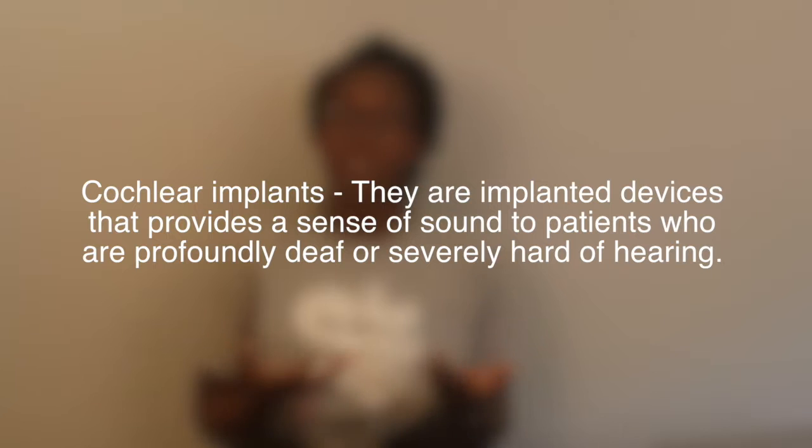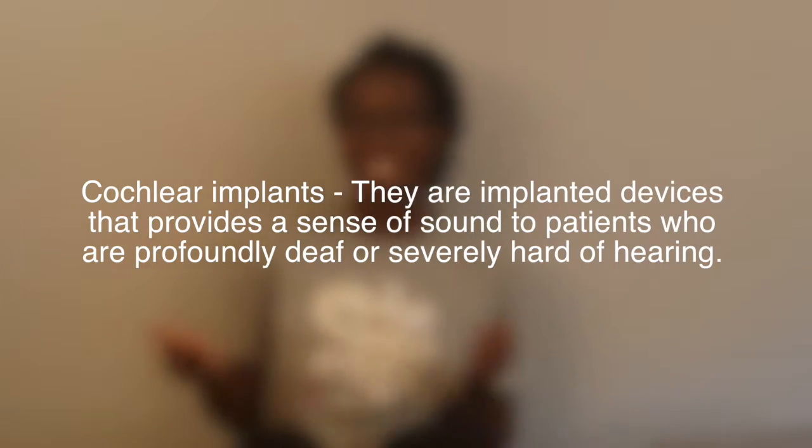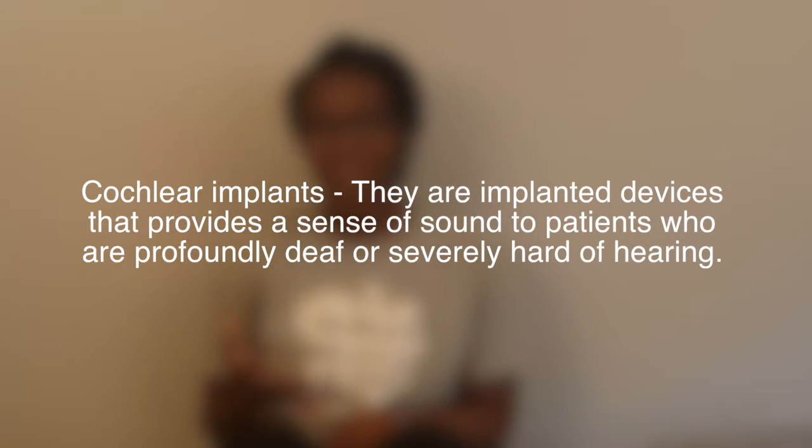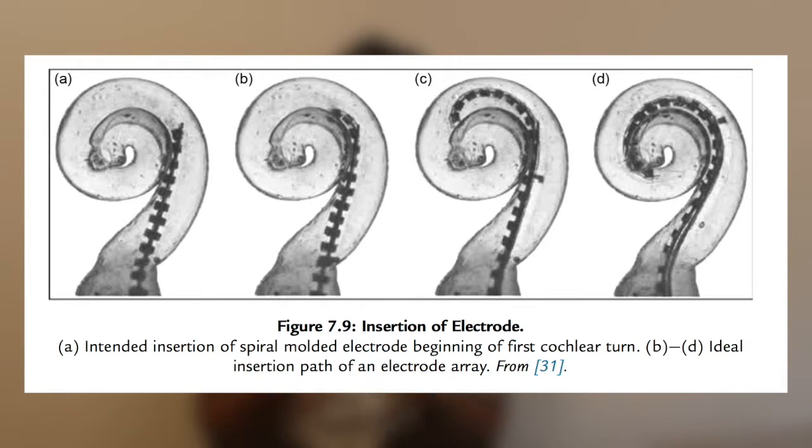And these implants are basically an implantable device made of a microphone that picks up sounds from the environment, a processor which processes the sound signals and selects the information to be sent to the electrode, a transmitter and a receiver that transmit the signals to the stimulator, which generates electrical impulses, and an implanted array of electrodes which stimulates different regions of the auditory nerve.